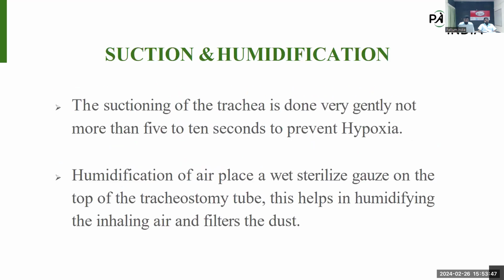Next, suction and humidification. Even after the surgery, or after placing the tracheostomy tube, suction is frequently needed. But whenever doing the suctioning, the trachea is done very gently, not more than 5 to 10 seconds, because we need to prevent hypoxia. So within 10 seconds, one time we need to do the suction and remove the suction cap.